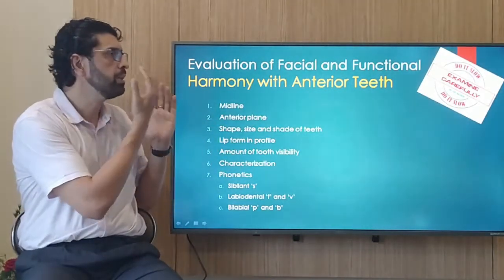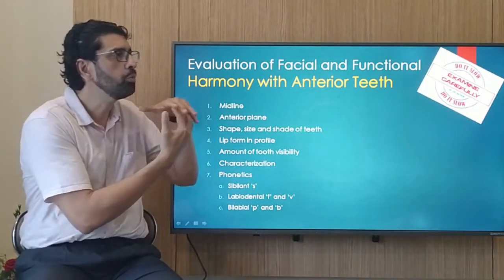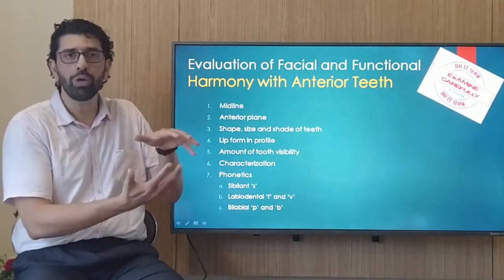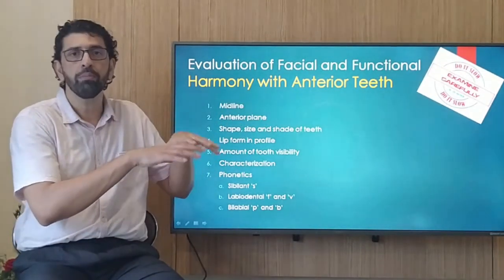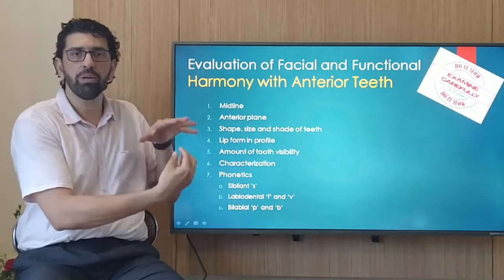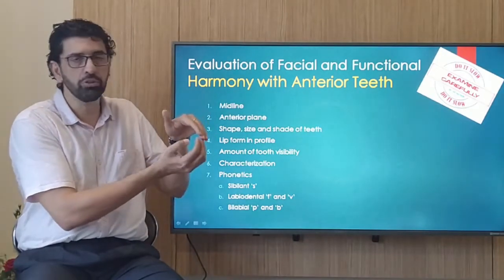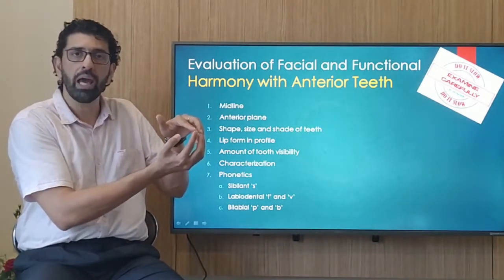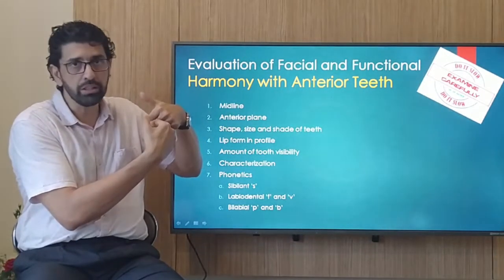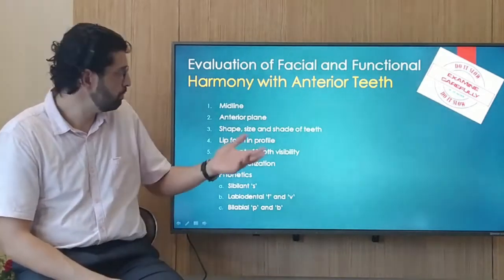Turn the patient's face. You want to see that the lip form is adequately supported. It's not bulging out too much, not too protruded, or not too dished in. If it's well supported, you will find that the mucocutaneous border is up and the wet line is seen, and that is how it should be. The contact should be between wet line to wet line and not mucocutaneous junction to mucocutaneous junction. If it's unsupported, you probably have that look, so it's important that it is well supported.